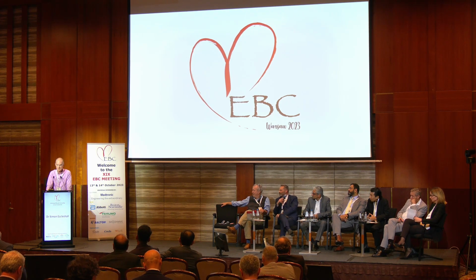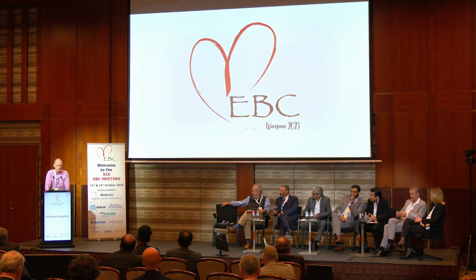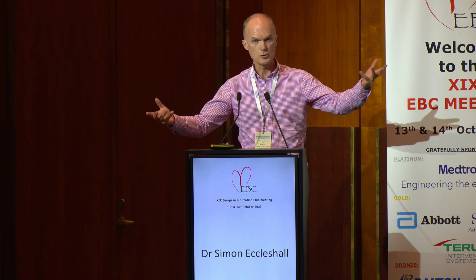The alternative, which hasn't been done much yet, but has been done in some studies or ongoing studies, is what I'd call strategy randomization, which is you take your pictures, you decide you can do everything that needs to be done in that patient, either with stents or with DCBs, then they're randomized to one arm, and they have to stay in that arm. So if they're in the stent arm, everything gets stented. If they're in the DCB arm, everything gets DCB'd unless you have to bail out on a specific lesion, in which case you bail out on that lesion, and the rest of the lesions remain in the DCB arm. So there's two different ways of doing it. It's either strategy or device.